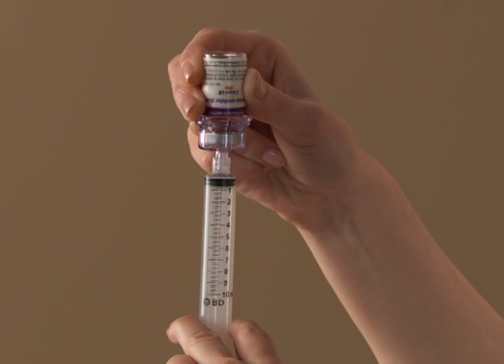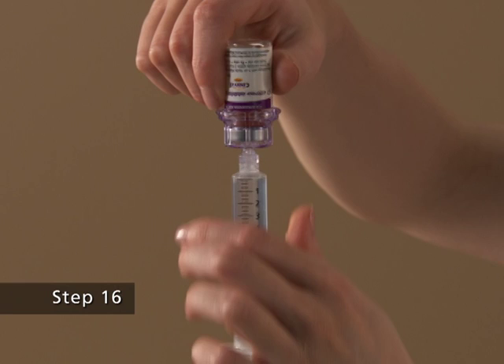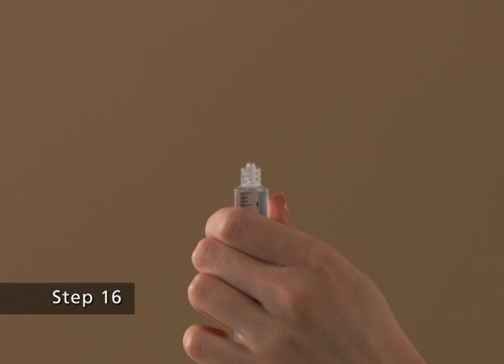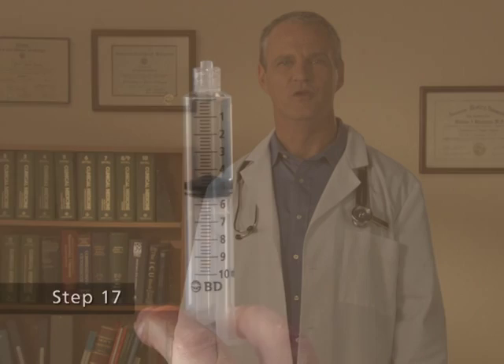Step 15. Slowly pull as much dissolved Synrise as possible into the syringe. Step 16. While holding the vial upside down, detach the syringe from the vial by turning it counterclockwise and releasing it from the Mix 2 vial transfer device. Step 17. Remove any air bubbles by gently tapping the syringe with your finger and slowly pushing the air out of the syringe.